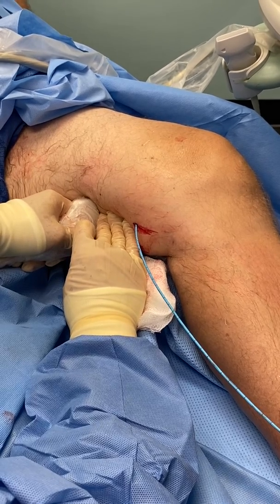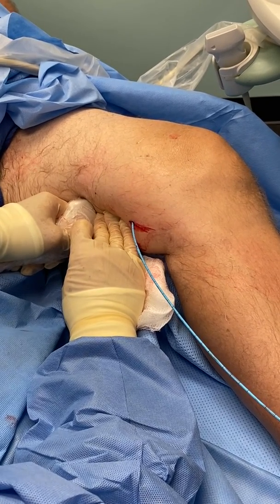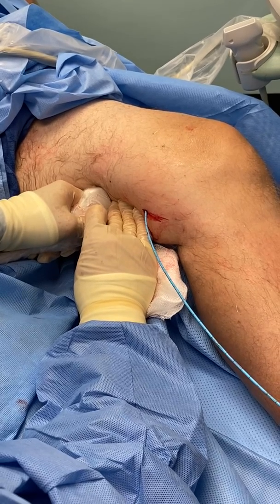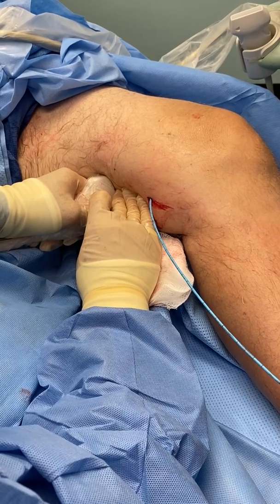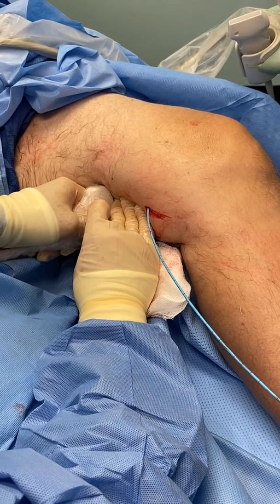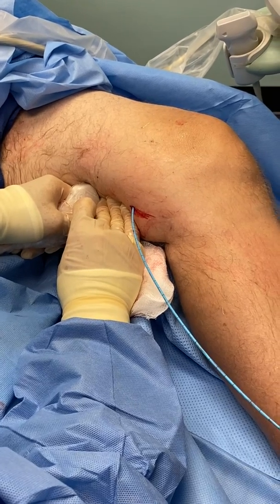So the procedure took, all in all — how much time do you think? We started the actual procedure about 30 minutes when you walked in. As you see, most of these procedures consist of putting everything in the right place, which can be more or less difficult. Sometimes it's pretty easy; sometimes we want to be very careful, so it's better to err on the side of caution and go back and do things if we need to. Now to remove the catheter.